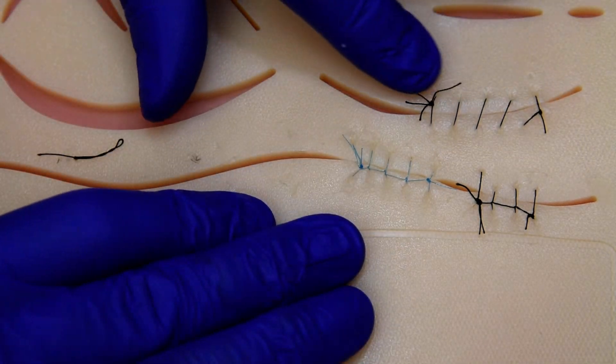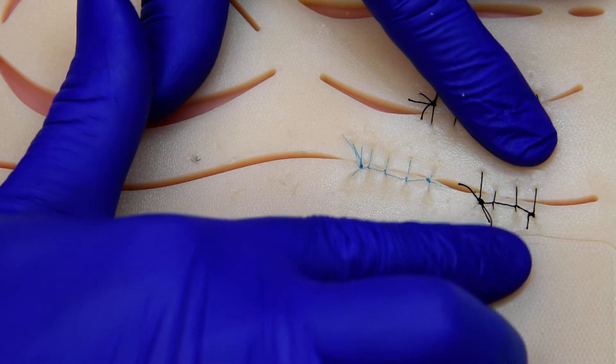So we have a simple continuous, an interlocking continuous, and a double interlocking continuous.